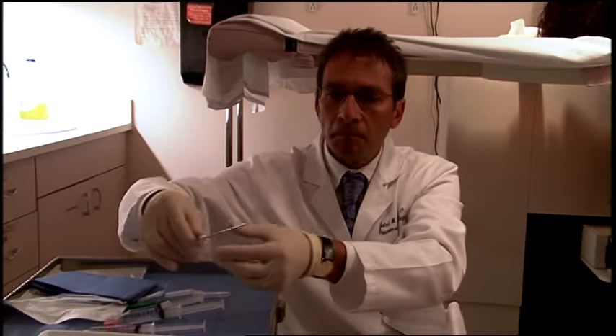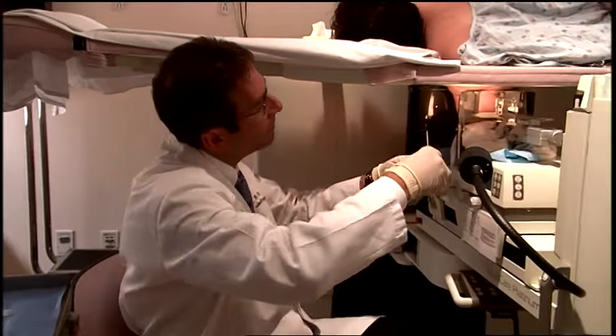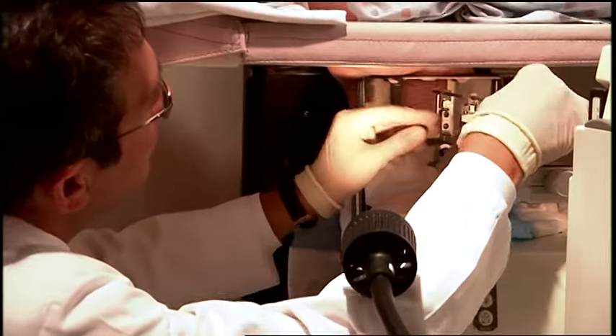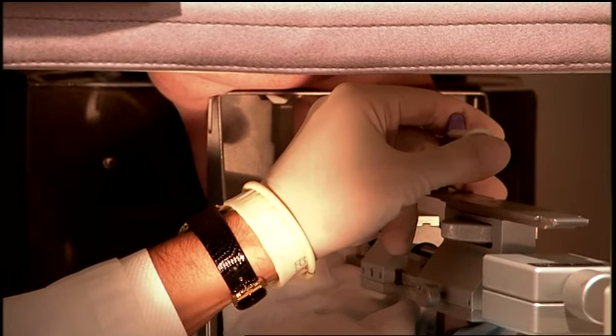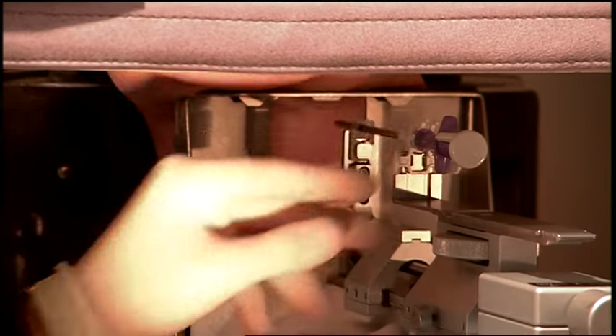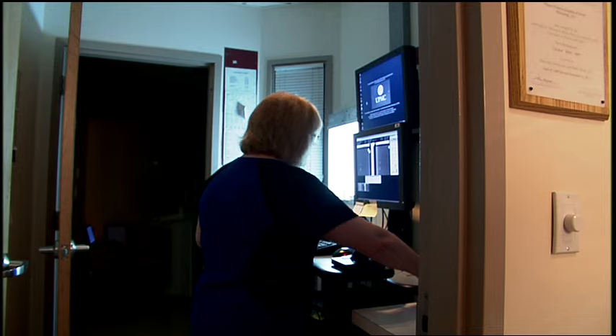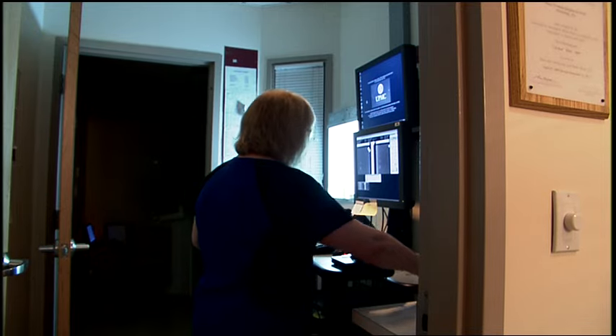A marker is inserted into the biopsy site to make it easy to identify for future testing or surgery. The marker is made of titanium and poses little, if any, health or safety risk. Patients usually are not even aware of its presence. Another image is taken to confirm that the marker is in the right place.